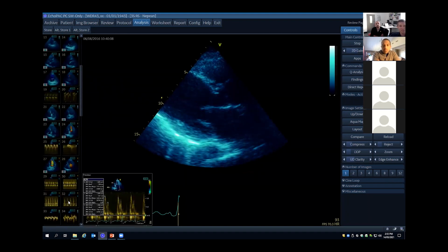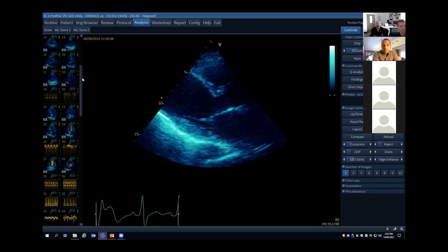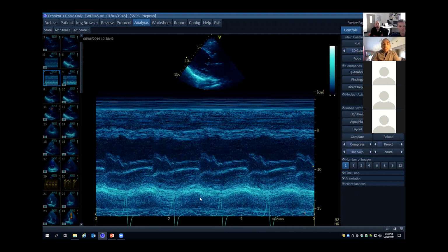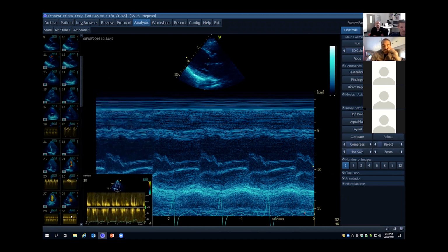Nice, fantastic. So if I can see the M mode for the mitral valve first. I don't have that. Oh, sorry. Looking for a B bump. Nice, oh cool, all right, which looks like it might be present. So the B bump is suggestive of at least moderate diastolic dysfunction.